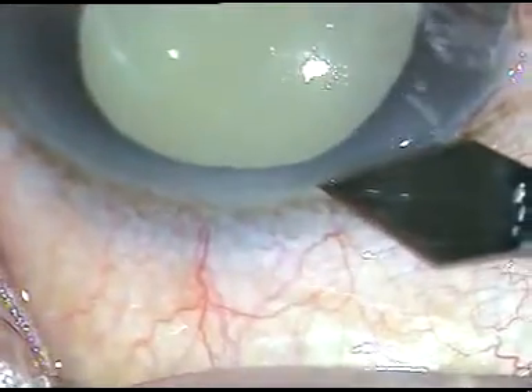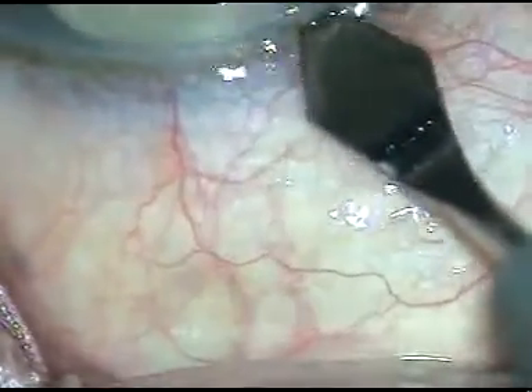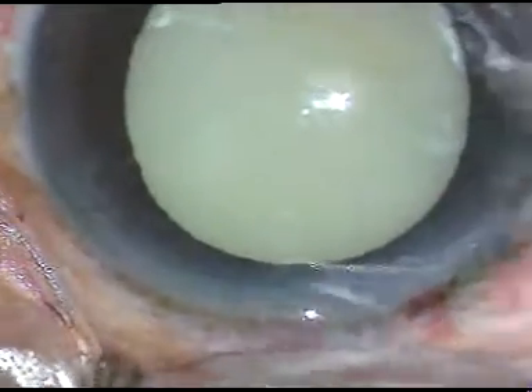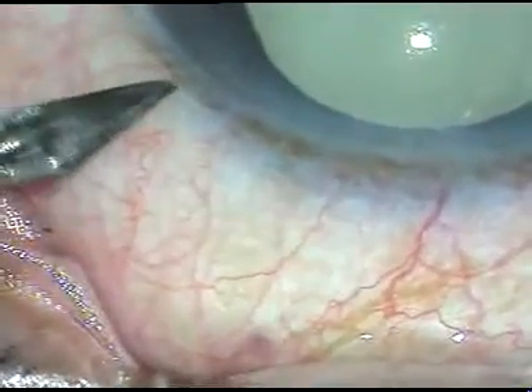Dear colleagues, this is a hypermature morgagnian cataract. In hypermature morgagnian cataract, the cortical lens matter liquefies and turns into a milky fluid. Surgery in some cases imposes some challenges in front of us.